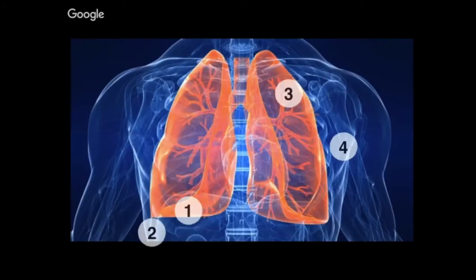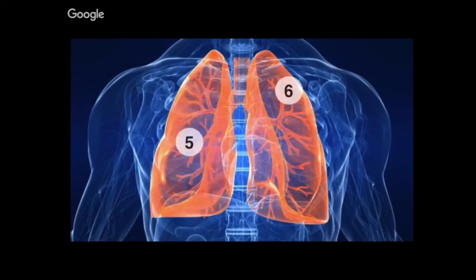So anterior, mid-clavicular, and axillary. Then the same thing on the contralateral side. And then you repeat over the posterior chest. In the quick EFAST approach, let's say you're dealing with a trauma patient, you could use the ultrasound to rule out pneumothorax by looking at the most anterior aspect of the chest in a supine patient. That's usually where the air will pool.